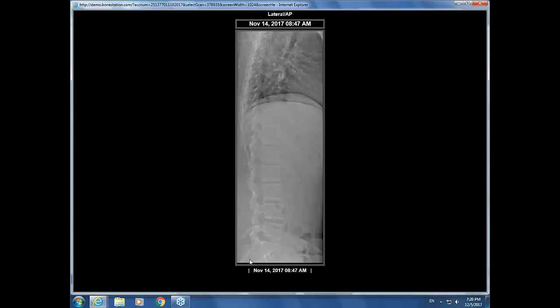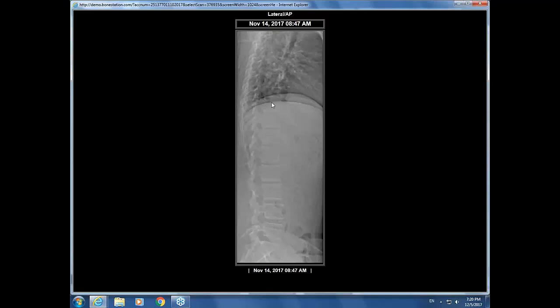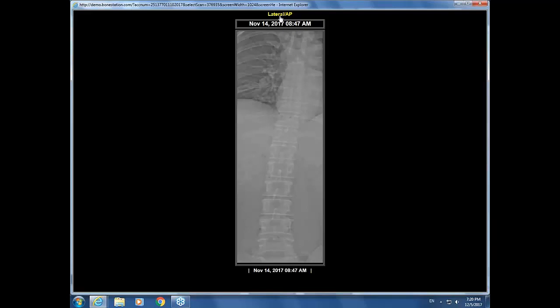On the lateral view — easier to see in the lightbox — this is the sacrum with the overlying iliac crest. Then L5, L4, 3, 2, 1, T12, 11, 10. On the lateral view I really can't see clearly past T10 — up there it's all kind of a big smush. So I couldn't say much about the integrity of vertebrae above T10. If you click on the AP view, you can see why: when the spine isn't straight due to scoliosis, the beam isn't parallel and it's hard to get a good look. On the AP view I can see down to about T7 with no fractures; on the lateral I really couldn't see above T10.